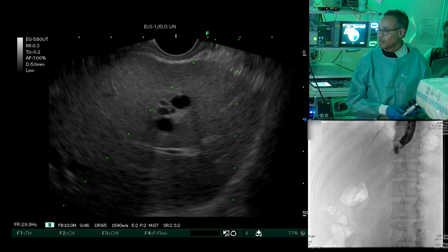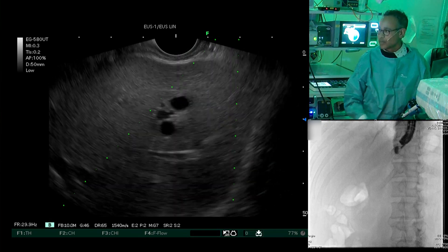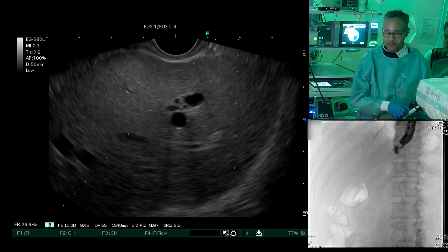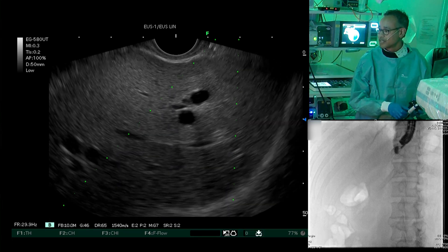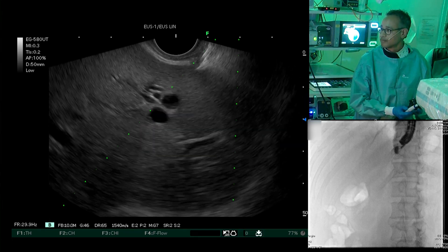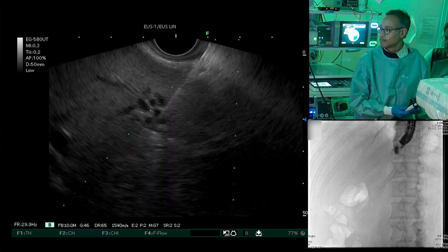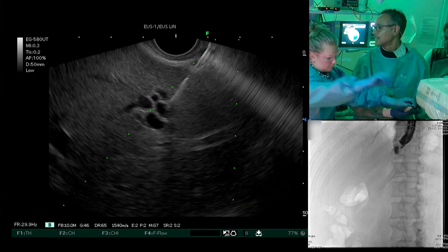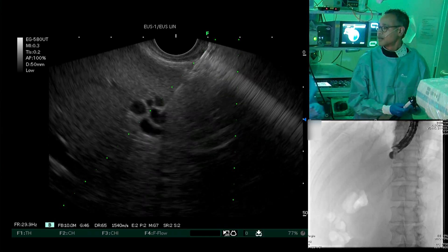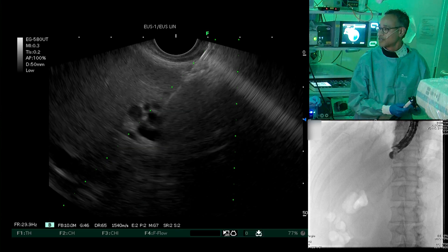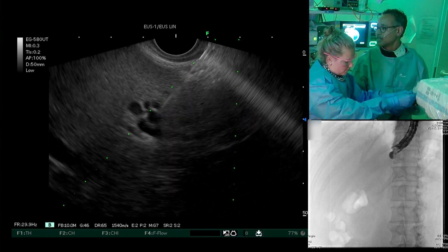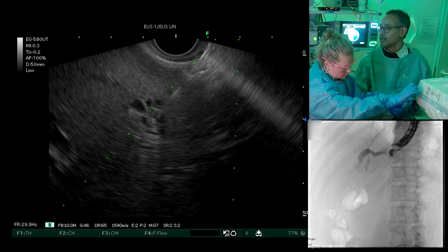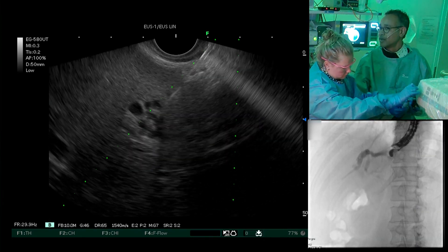The first step is introducing the needle into the liver. We're going to aspirate a little bit of bile, and then introduce contrast via the needle. We have bile. Next up is contrast — we're going to inject some contrast and I'm going to show you with fluoroscopy that we're in the intrahepatic biliary system.